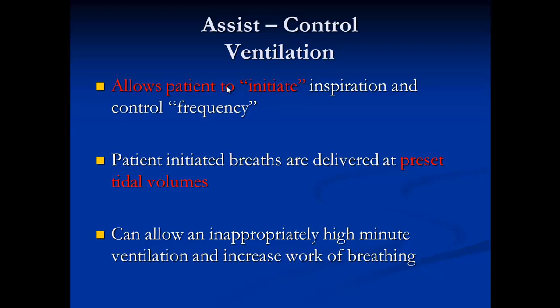So in other words, it allows the patient to initiate inspiration and control the frequency. Patient-initiated breaths are delivered at a preset tidal volume and a preset rate. It can allow inappropriately high minute ventilation and increased work of breathing, even though the main purpose of this mode is to decrease the work of breathing.